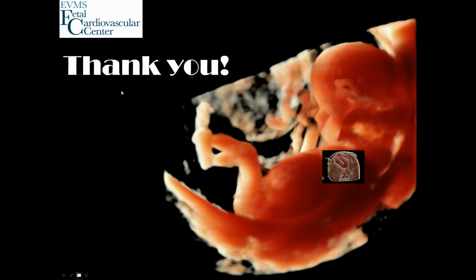Okay, so the next question: what PRF settings do we use for Doppler to visualize the four-chamber view, pulmonary veins, and other views? About settings. Usually we perform ultrasound assessment of the fetal heart in early gestation in the screening setting using the specific preset that in our practice we use for nuchal translucency. Many manufacturers of ultrasound machines now have a preset for evaluation of the pregnancy in the first trimester, including specific presets for assessment of the nuchal translucency. If you use that preset, the PRF, or pulse repetition frequency, is already set up, and you can adjust it a little bit depending on the specific patient you're scanning.